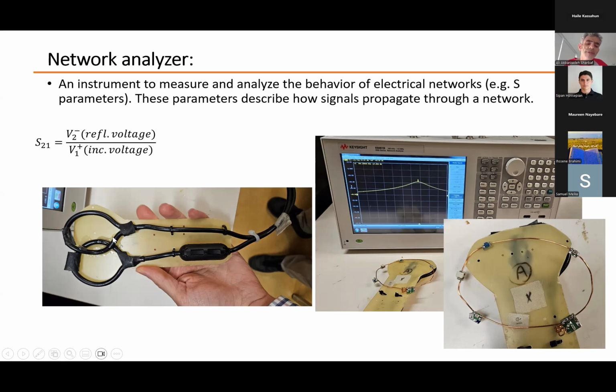Because of this overlap, only a small current is induced into the other loop, so there is almost no coupling between these two loops. Once we put the coil on the dual pickup loop, you see that at a certain frequency we have a peak. Why?